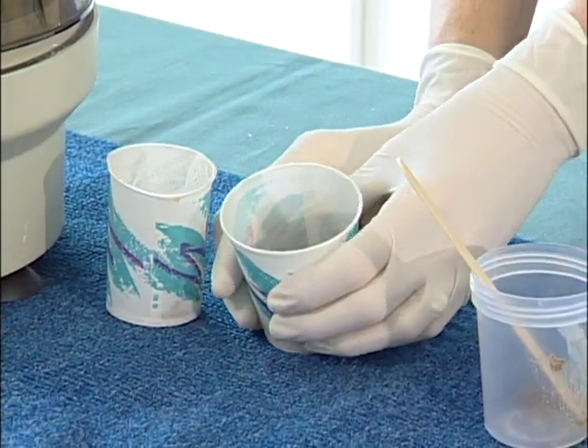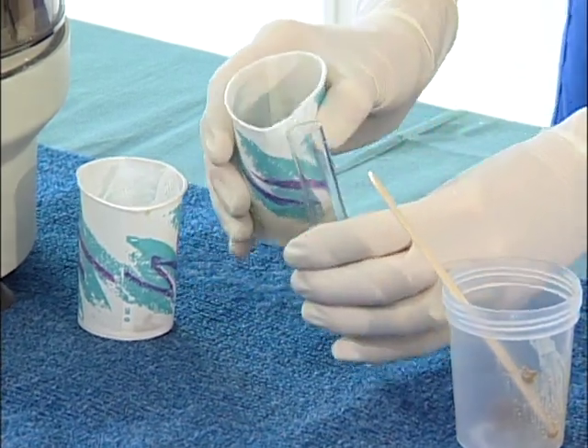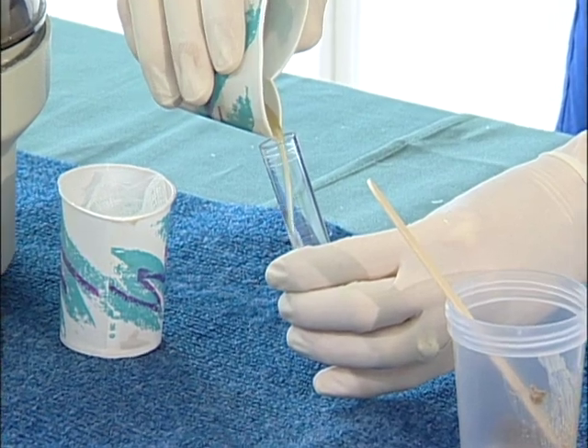Now we are going to take our supernatant and pour it into a 15 milliliter conical tube. We are going to fill it up to approximately 12 milliliters.